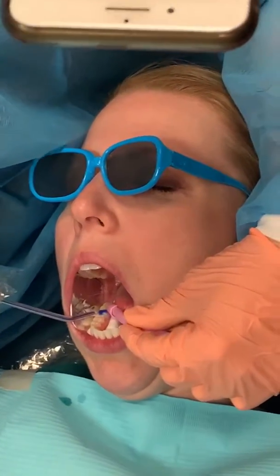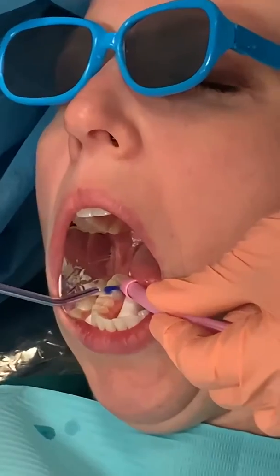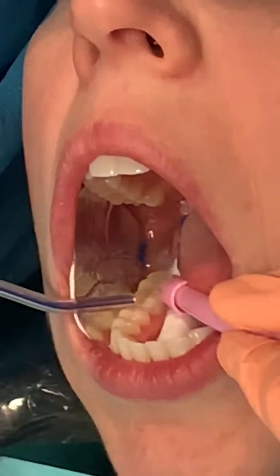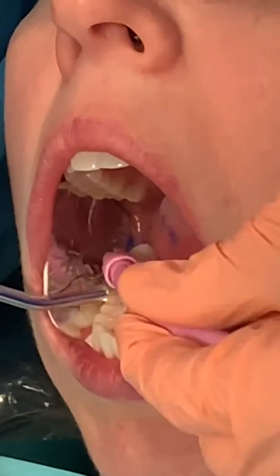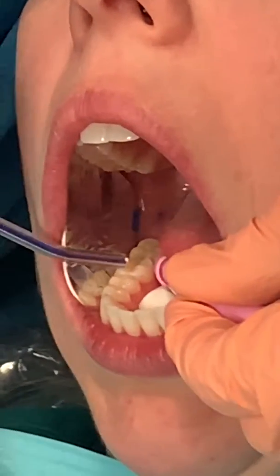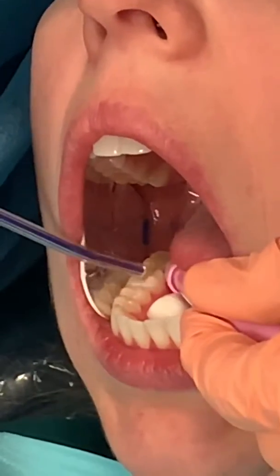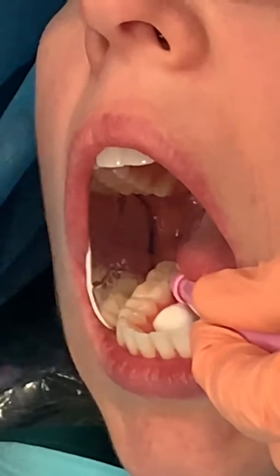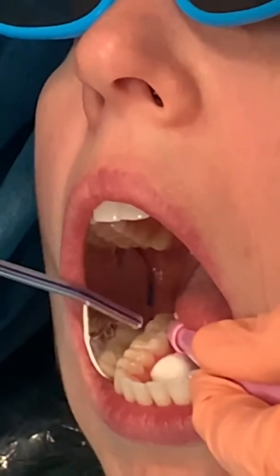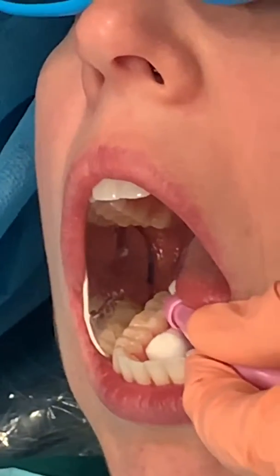So it's been on there 20 seconds. Do you see how I'm going to spray the water across the tooth into the suction? I use the low speed because I just don't feel comfortable with the high speed in the mouth. Did you see how I came out here and blew the air off because I got all the air out of the line? And then I'm going to dry this off until it looks chalky — I feel like that's good there.